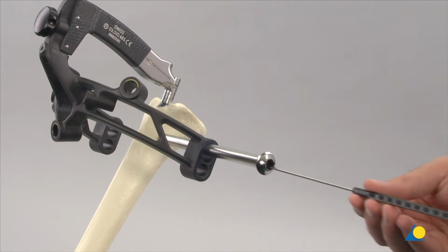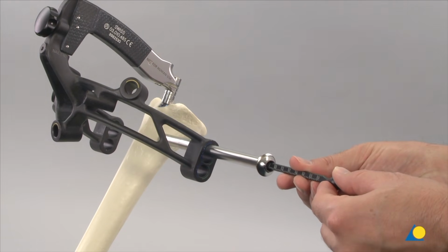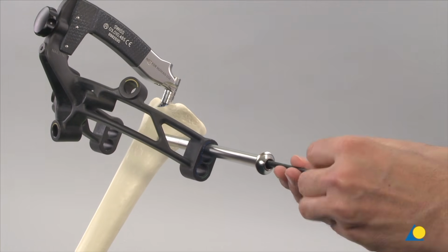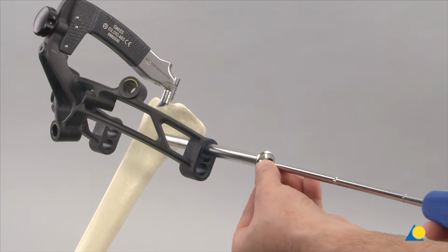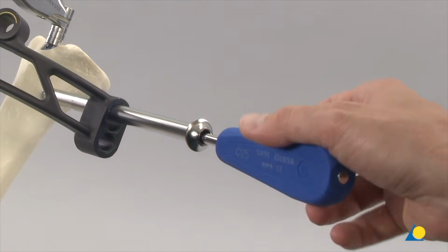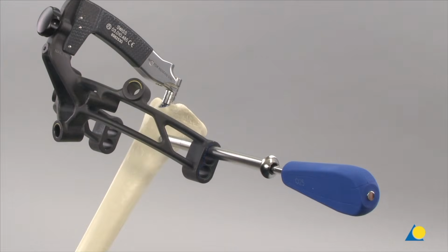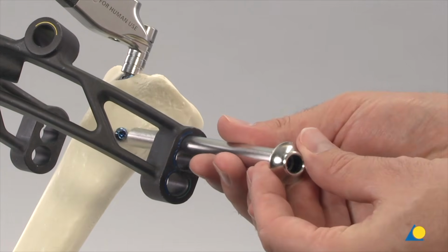While ensuring that the protection sleeve is pressed firmly to the bone, the measuring device is slid through it, making sure that the hook grasps the far cortex. The length of the first locking screw is read from the measuring device at the back end of the protection sleeve. The 4.0 locking screw is inserted through the protection sleeve and threaded into the hole with the screwdriver Star Drive T25. The screw length is verified under image intensification. The tip of the locking screw should not project more than 1 to 2 mm beyond the far cortex. After the length of the screw has been verified, the screwdriver and protection sleeve are removed.